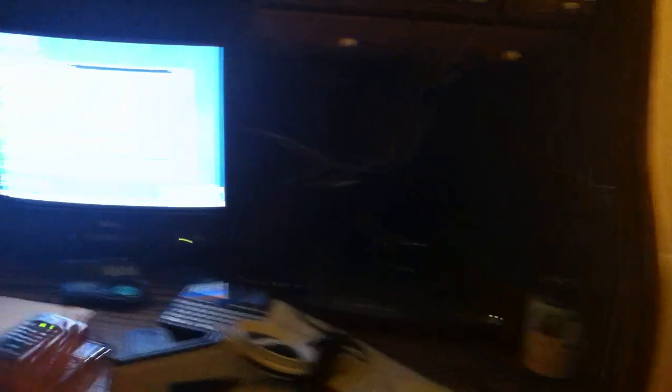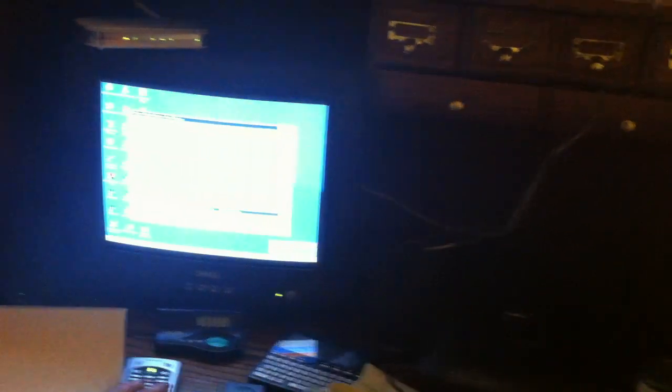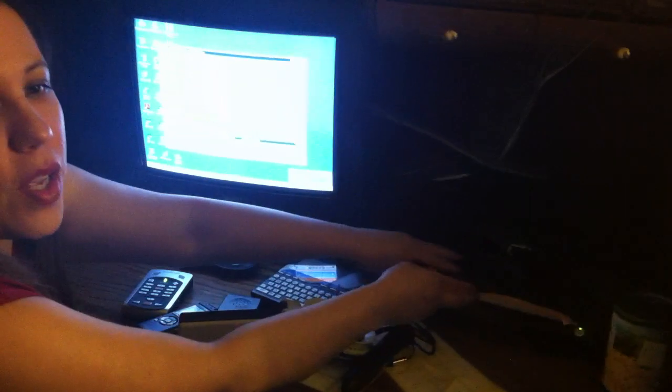I also have a scanner. I almost forgot to mention. This is my scanner and it has a software, which has a screen program, a speech program called Kurzweil, which is also installed into the computer. So if I want to read, say for example, a newspaper or magazine, I just put in the piece of paper there and then I just scan it and it'll go into the computer and I can read whatever handout.